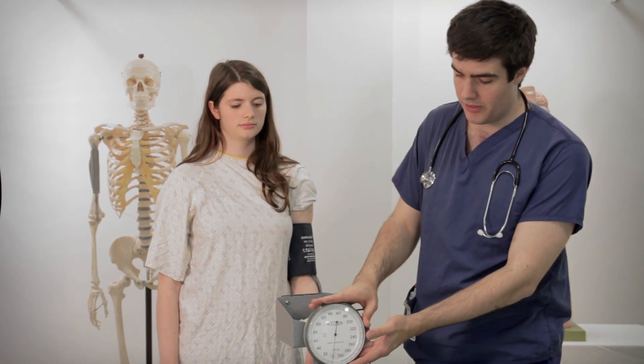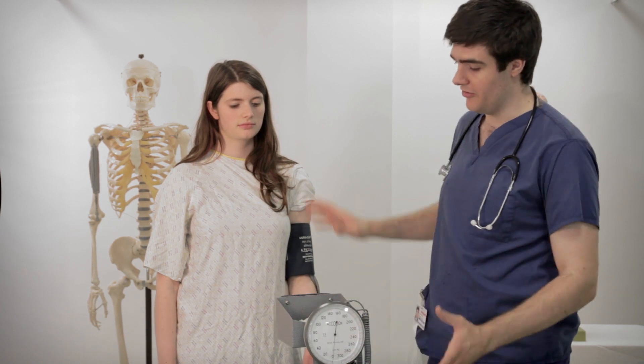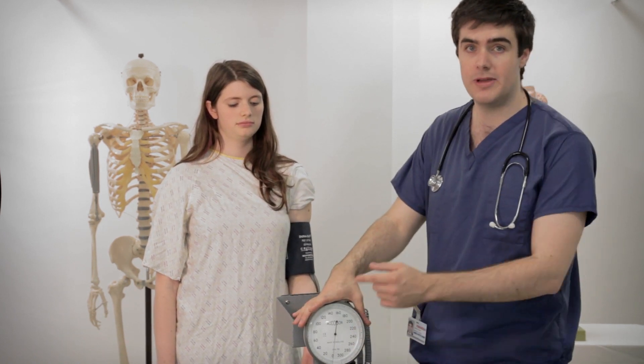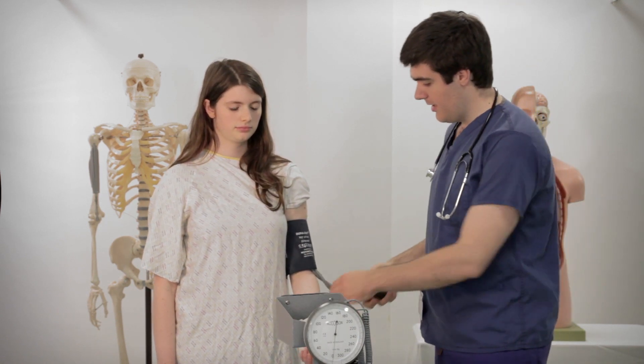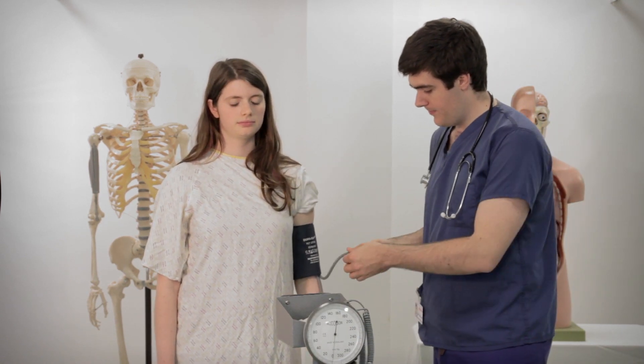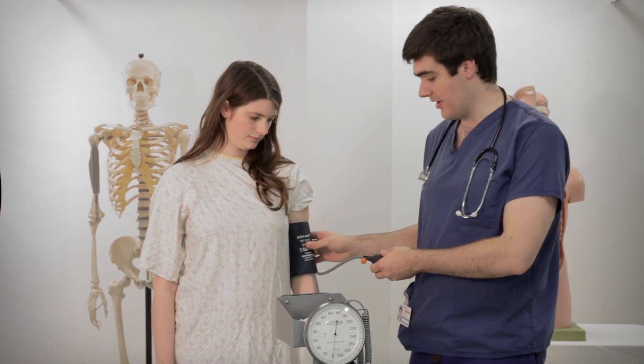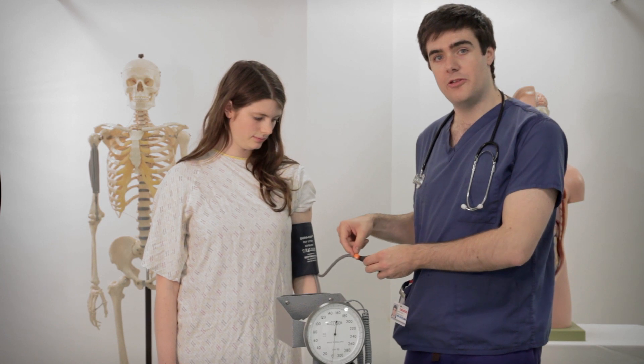So we measure it with what's called a sphygmomanometer, which is the setup here that we've got. This is quite a large sphygmomanometer so you should be able to see the dial going up. This is a little valve that I use to squeeze to inflate air into the cuff and I can twist this to adjust the pressure in the cuff.